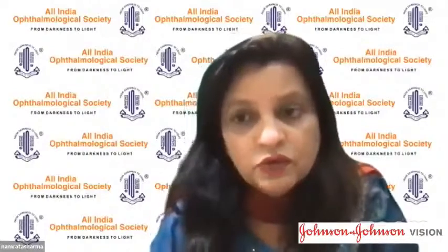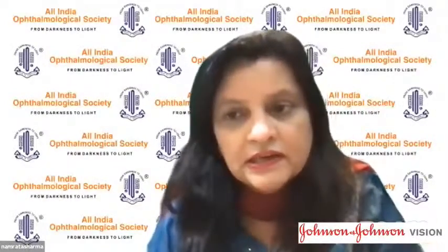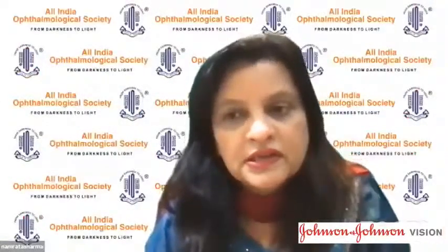But of course, if you have a posterior capsular defect, then you have to offset it a little bit more anteriorly because you can't go through and through. And also, the energy might have to be played with a little bit more. Yeah, offset, and maybe I would also go with a technique which uses less energy so that there are fewer cavitation bubbles as well.